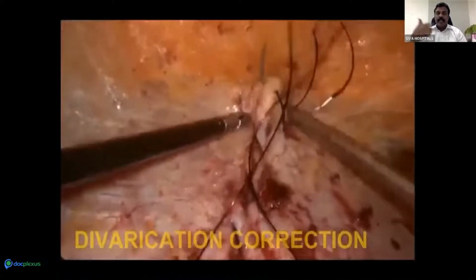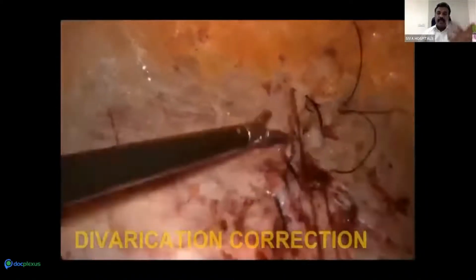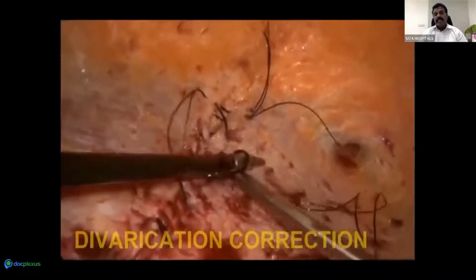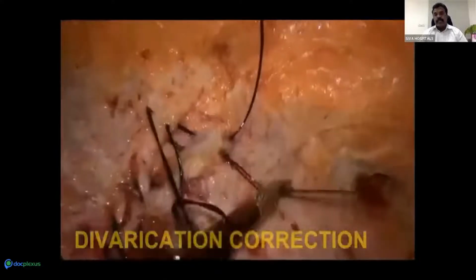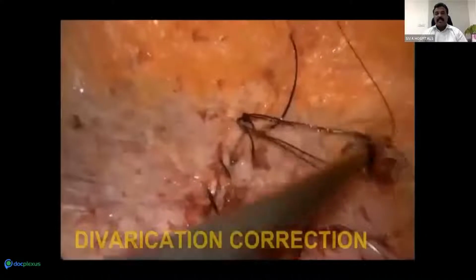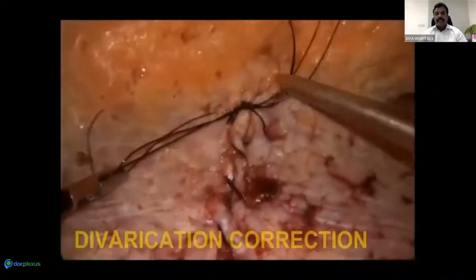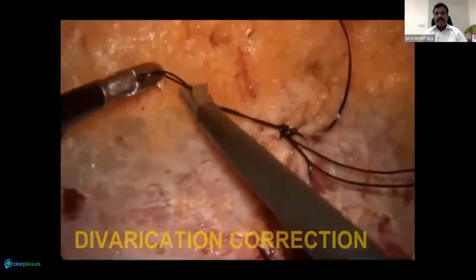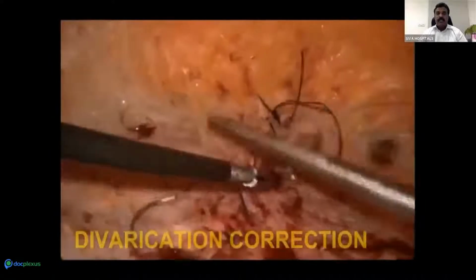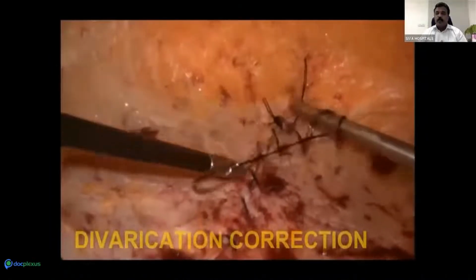Then you have to complete the suturing up to the xiphisternum. Take the same suture which is left over at the end, take one suture there and put a knot near the xiphisternum. Now pull the outer part which is left over, then complete the suturing. So the augmentation is over.